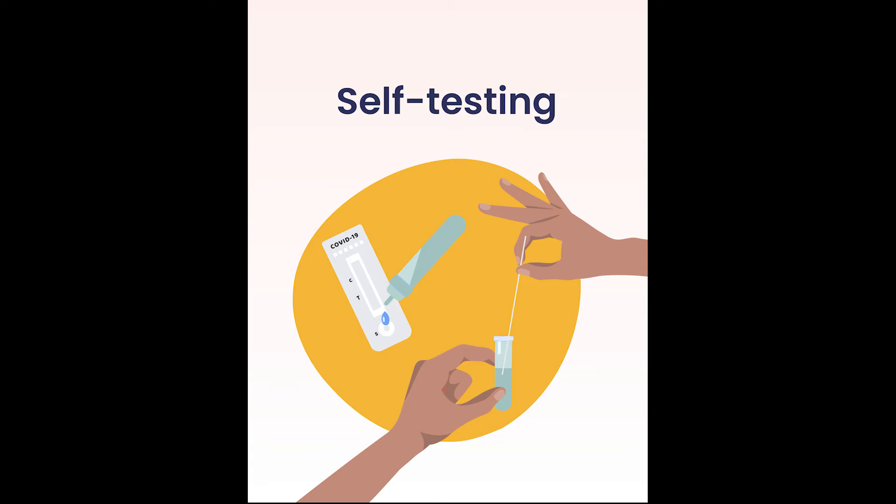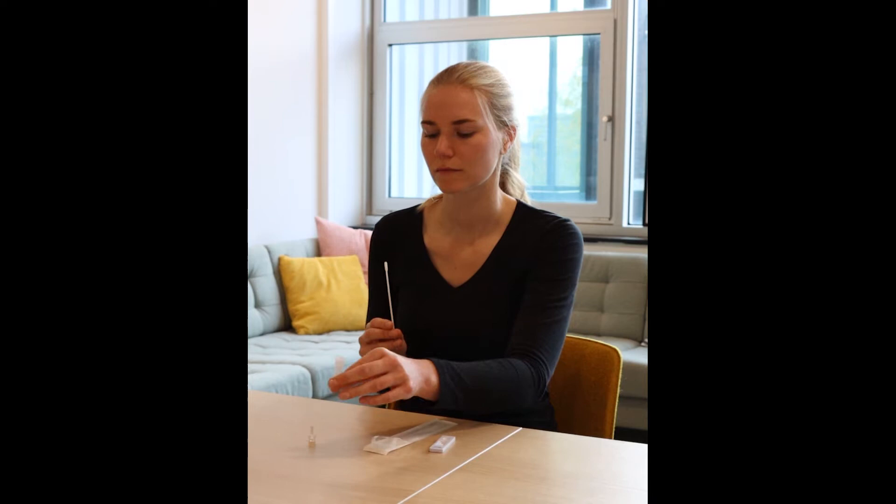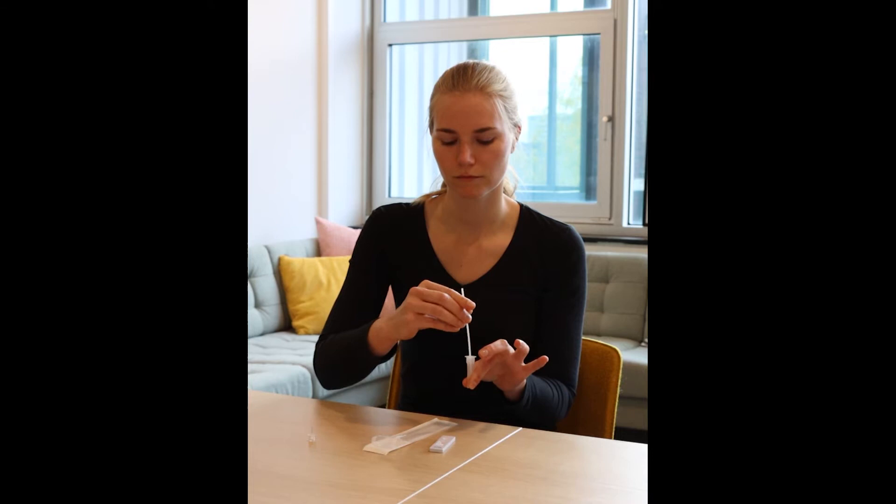Self-testing. Place the cotton tip of a swab in the tube so that it is dipped in the liquid. Press the tip against the edge of the tube with force while rolling it around for 15 seconds.